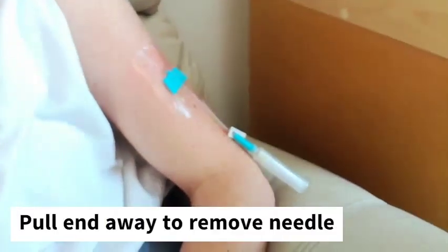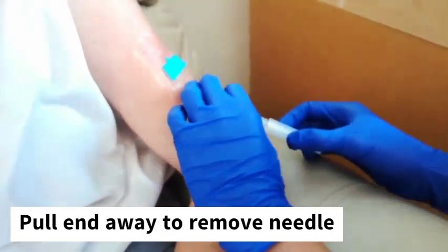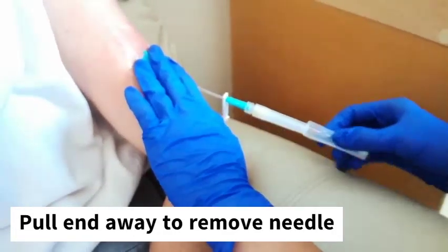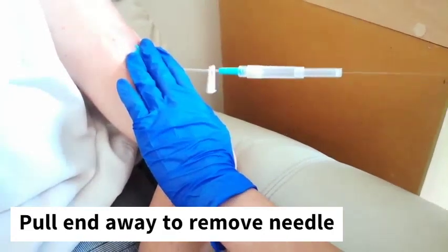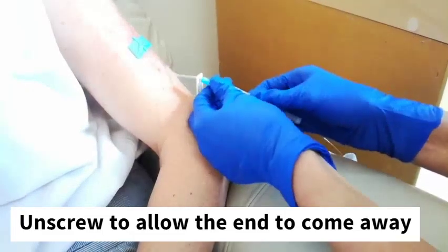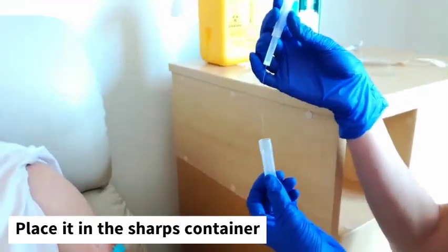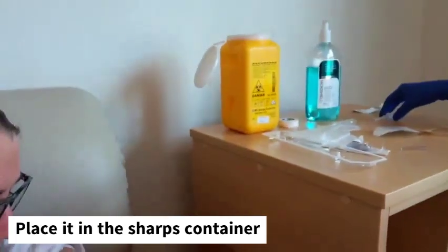Now we need to remove the end of this cap — it helps to have that in place. We pull at the bottom all the way, and this will take and remove the needle with it. So this removes itself, and the needle is contained and we can put it away into our sharps container or by the side before we're ready.